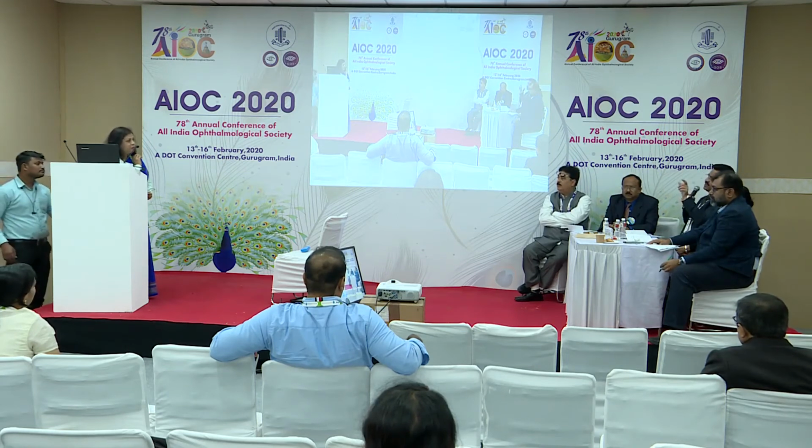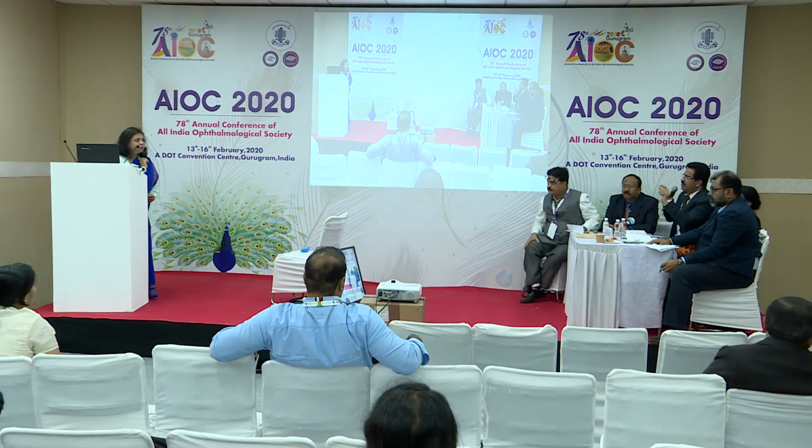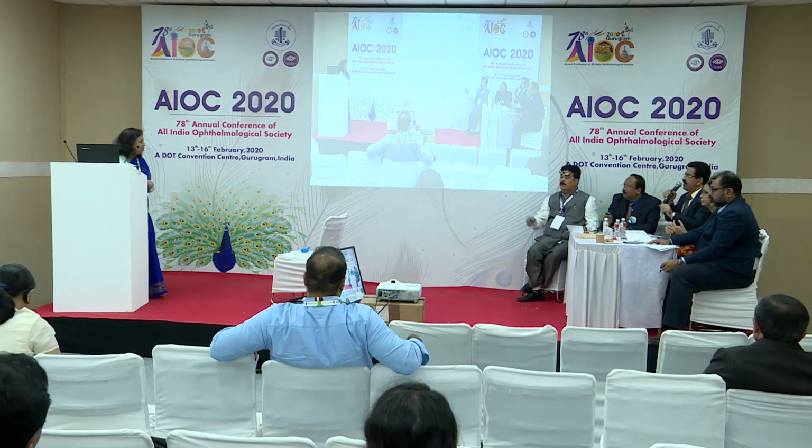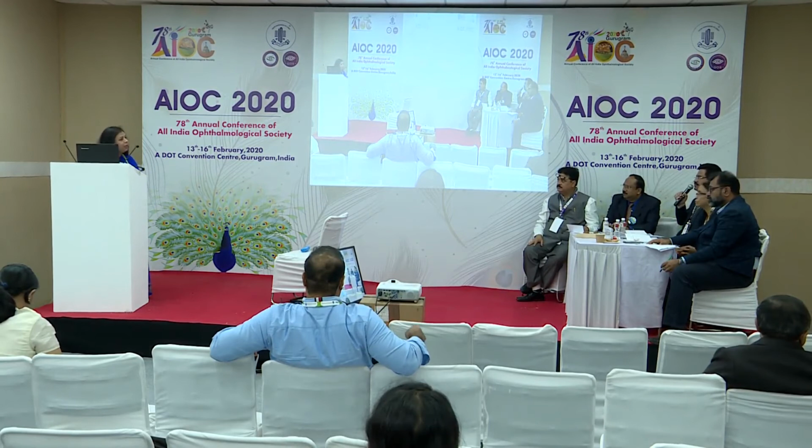At what diameter is it taking the keratometry? Pardon, sir? Sir, I could not hear. At what diameter is it taking the keratometry? 2 millimeter, 3 millimeter, 3.5 millimeter? Sir, actually the automated keratometry that we were using was the KM100 of a Taiwan make. In that we used to go 50 centimeter from the cornea. And the orange colored gold dots used to be focused on the cornea.